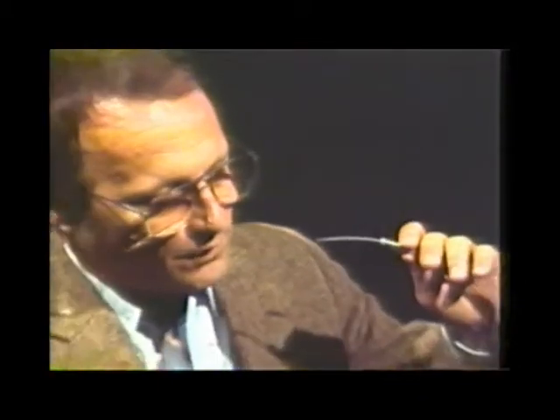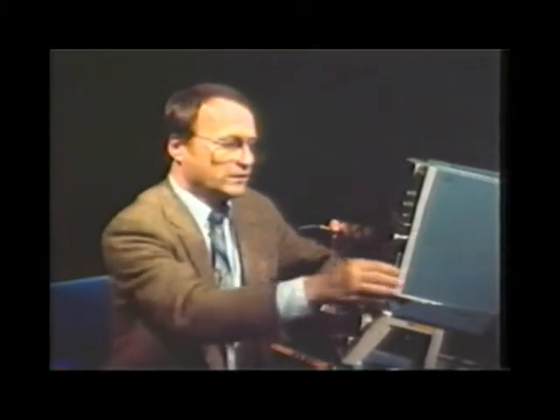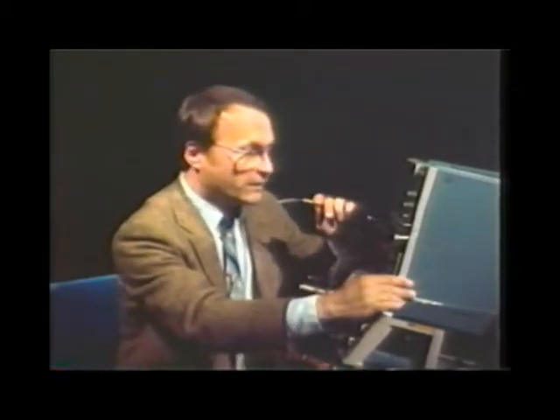This tube goes down to a pressure transducer, and the pressure transducer output is displayed on the oscilloscope here. I'll give you a sample now of just saying pa, pa, pa repeatedly, and we'll look at this waveform.